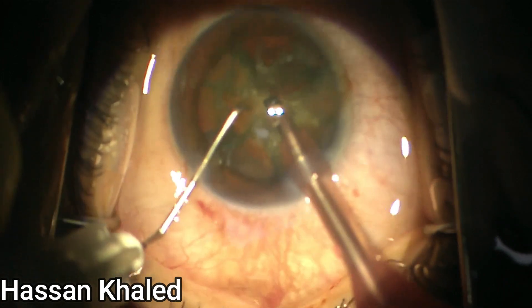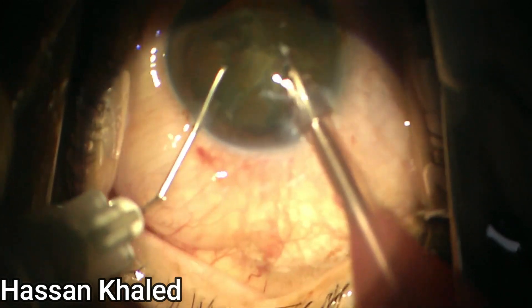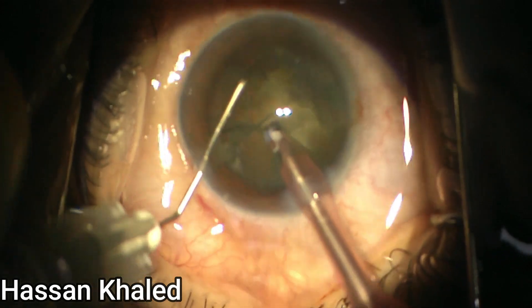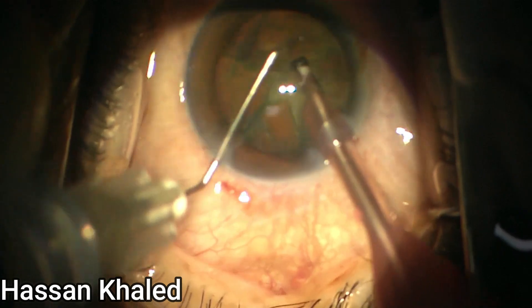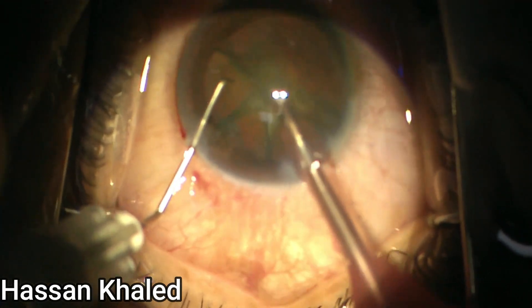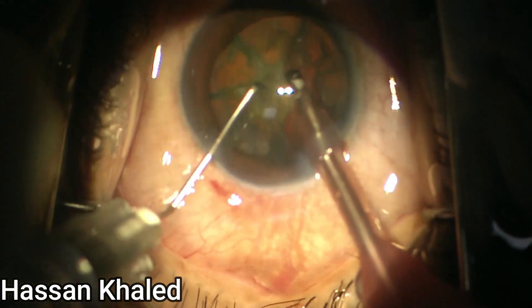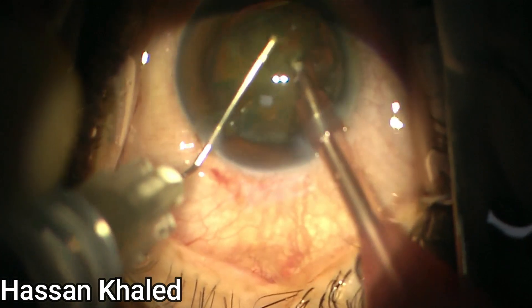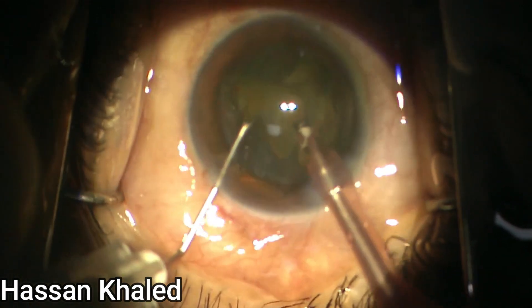Now you can just hold each small piece and lift it slightly up to the supranuclear level and emulsify it. Hold the piece and emulsify at the supranuclear level. You can rotate and continue emulsifying, and also continue chopping as you can see.